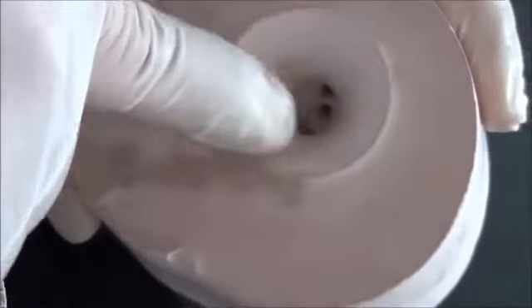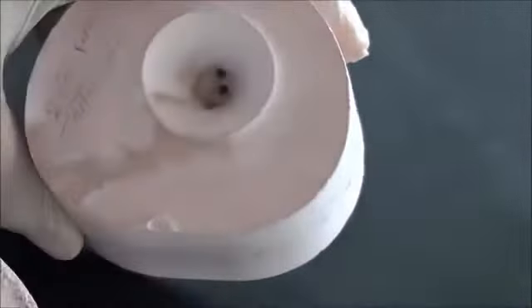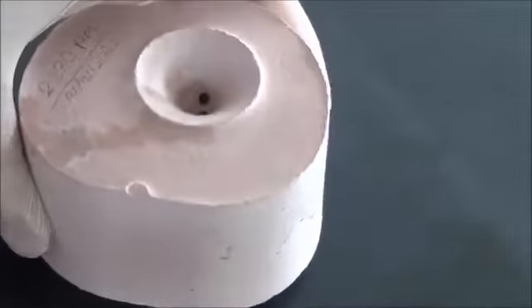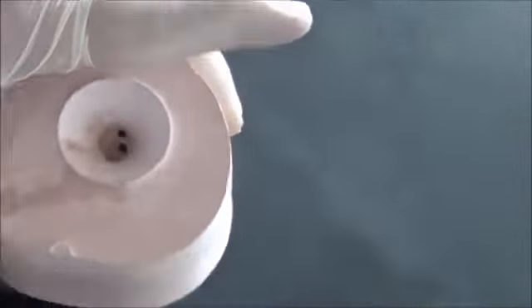This part is exactly resembling the funnel. These empty tunnels at the beginning are the exact duplication of the sprues, and later on inside you will have empty spaces where the metal framework wax up was done. Now this is ready to go to the casting machine.